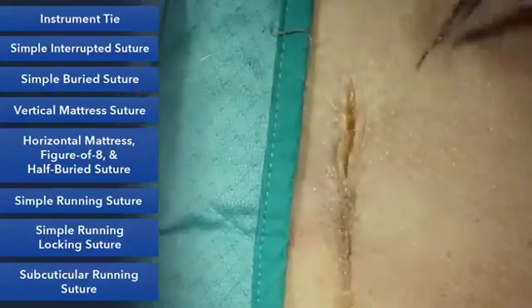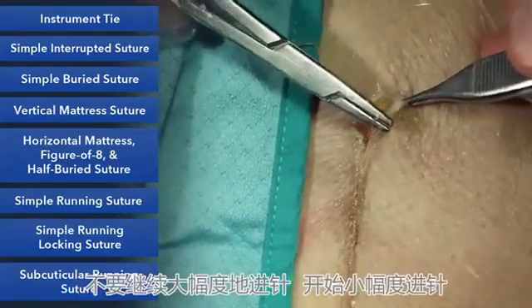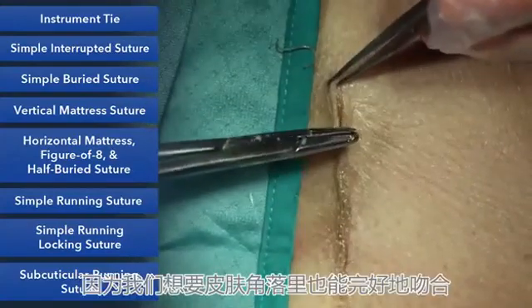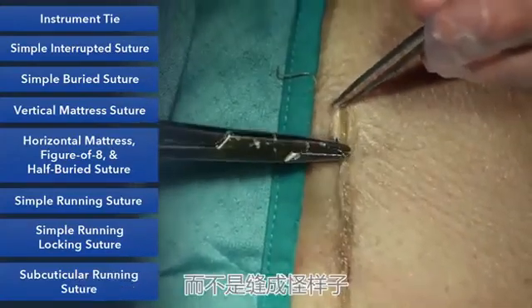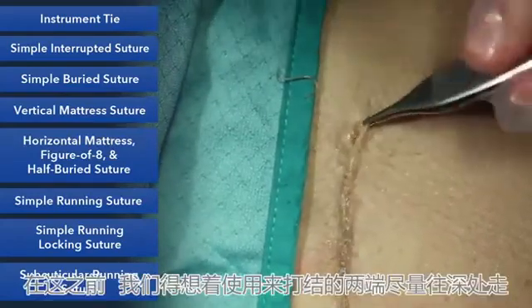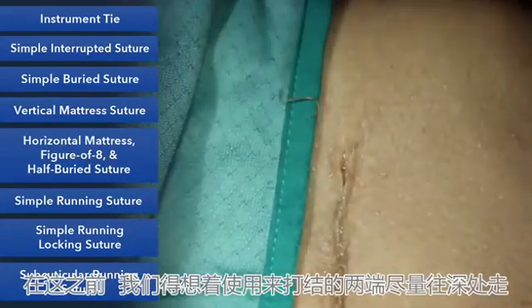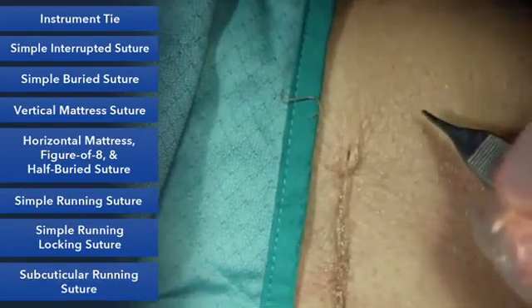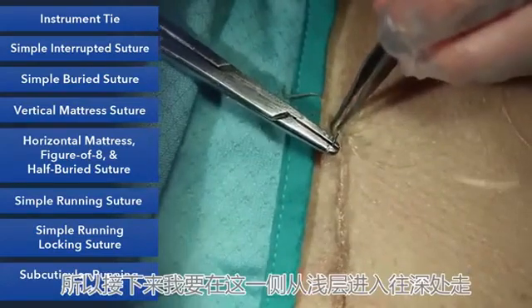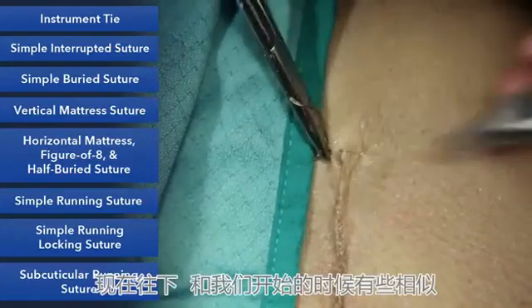And just like when we started, as you begin to approach the corner, you want to stop taking such big bites and start going to smaller bites, because you really want these skin edges to be well approximated at the corner and not create any dog ears. We also want to bury our knot. So if we're going to bury our knot, we have to start thinking about getting deep with both of the two ends that are going to get tied. So at this point here, I'm superficial, and I'm going to go superficial on this side and then head deep. That'll get me down to sort of where we started, down deep.